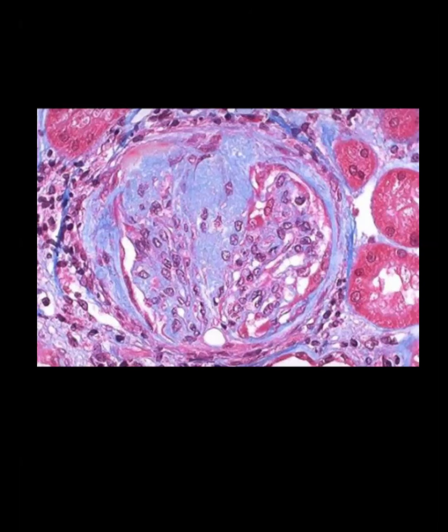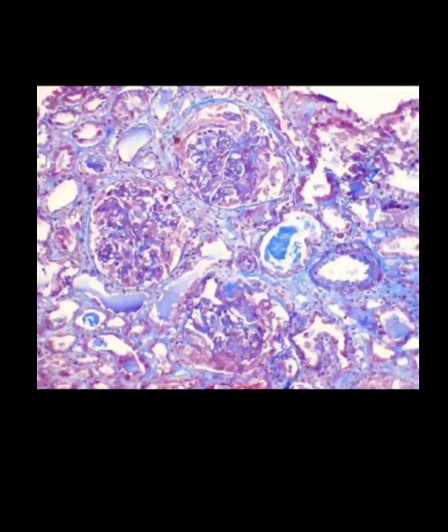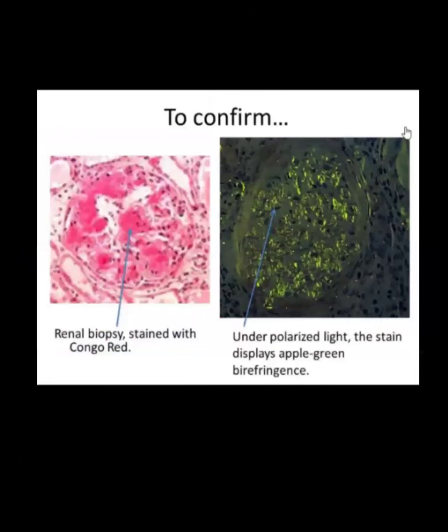The doctor is telling very right, brother. Thank you for helping me in my lecture, and you are putting in wonderful efforts here. So which stain is it again? It is again showing this blue area of fibrosis and sclerosis. Yes, it is a Masson trichrome stain. Again, this is a slide of Masson trichrome stain. Here again you can see the Masson trichrome.